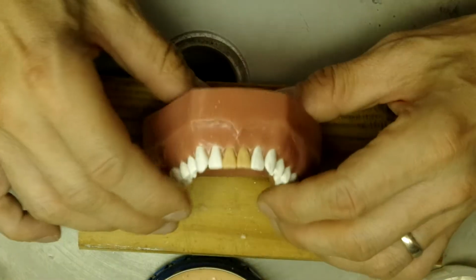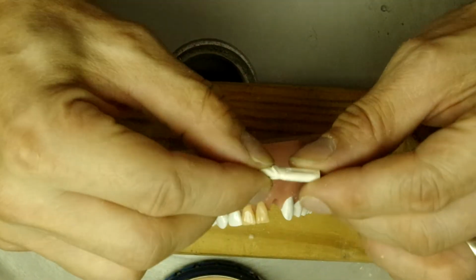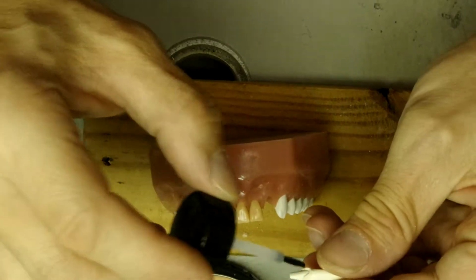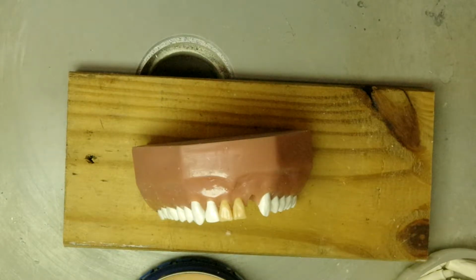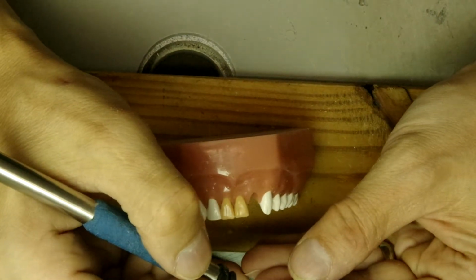Okay, so let's start with the laterals. This is number 26. So let's look at number 26 right there. A tiny bit of loop. And start the same way.